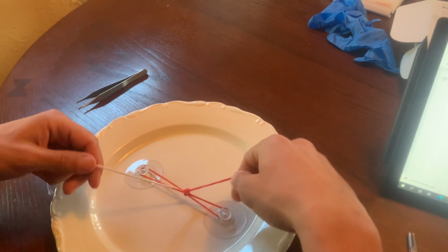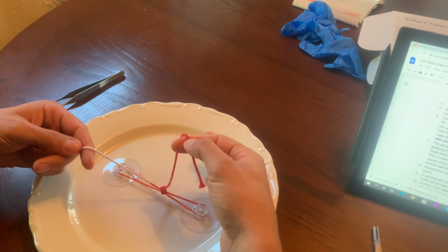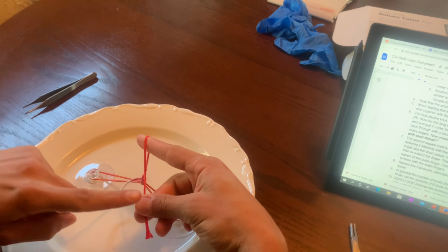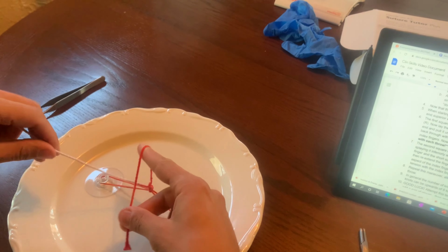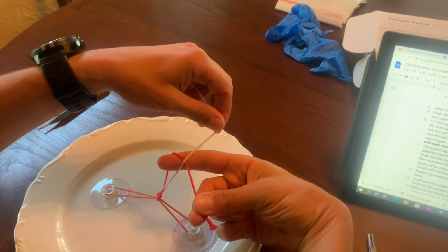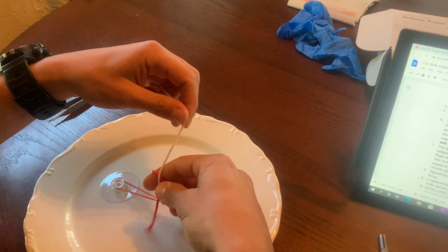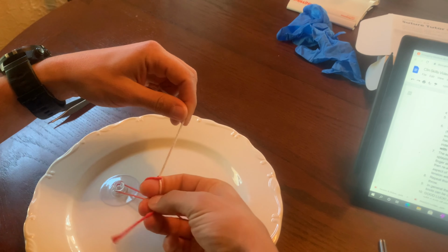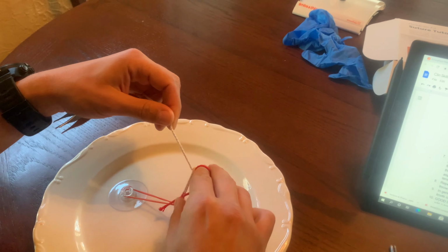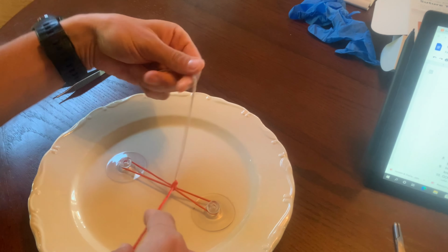All right. Next, the second square knot is completed by draping the short end over the index finger and splaying it inferiorly with the thumb and middle finger. Next, cross the long end over the index finger and the short suture. Flex and hook the long end of the knot with your index finger and re-extend the finger. This motion will catch the short end of the suture with the volar aspect of the index finger. Complete the knot by sweeping the short end through and placing tension with the index fingers.